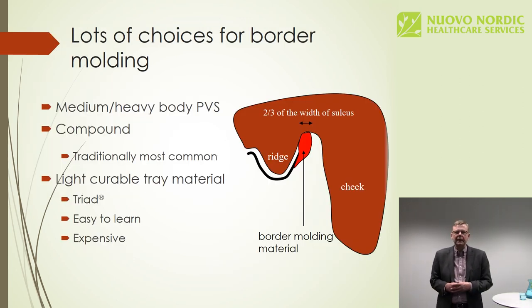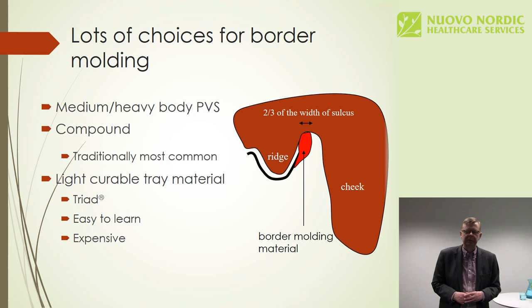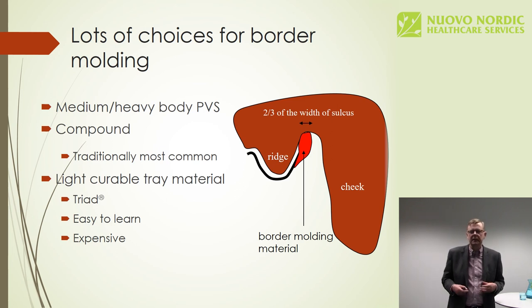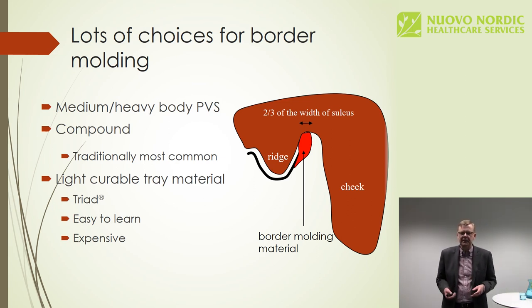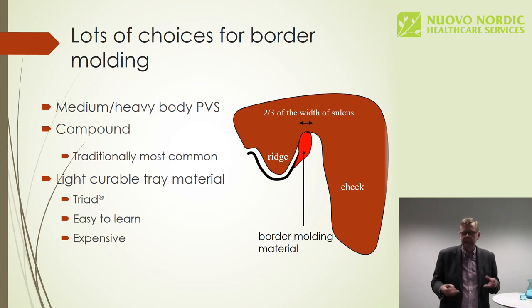The idea of border molding is to fill the vestibule, to make it as long as the soft tissues allow, which means the muscles and the ligaments will all limit and shape the border of the tray and the becoming denture. In this way, the denture won't loosen when the patient talks and does all the possible movements with the cheeks and mouth. For the border molding, we'll use a heavy or medium body material, polyvinyl, or compound. You know, compound, it's the traditional.